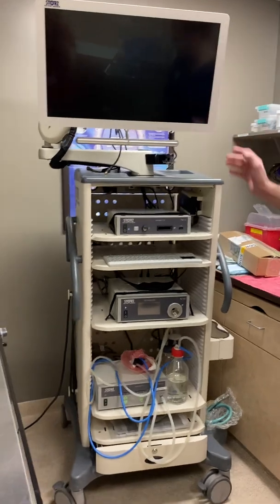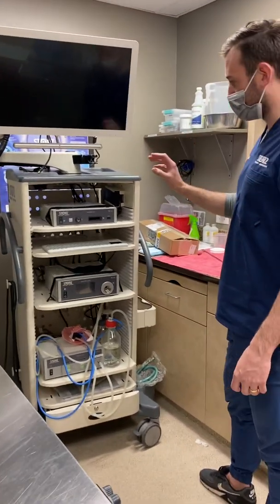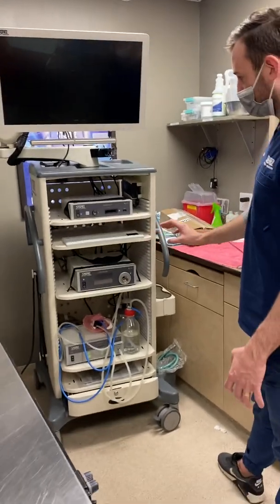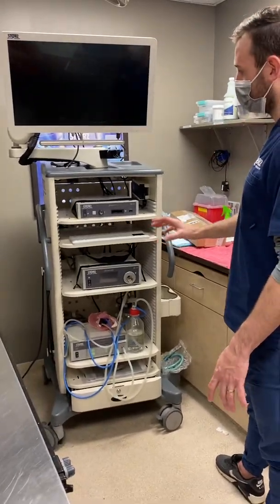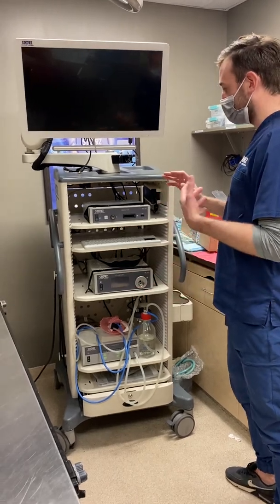This is the Storz endoscopy tower. I'm going to take you through what each of these boxes is, and then after that we'll go over turning the system on and setting up for cases.